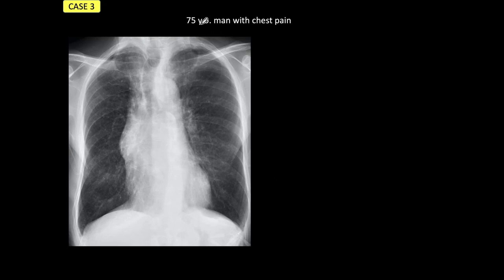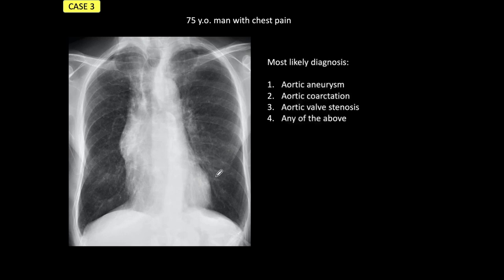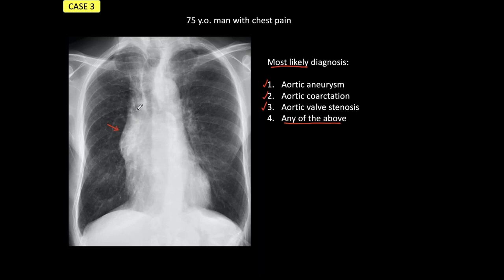Let's go to case number three. This is a 75-year-old man with chest pain. The chest is obviously abnormal. The most likely diagnosis could be: one — aortic aneurysm; two — aortic coarctation; three — aortic valve stenosis; or any of the above. Stop the presentation, look carefully at the radiograph, and come back with your diagnosis. The obvious abnormality is convexity of the ascending aorta in the right mediastinum — the middle part of the mediastinum.